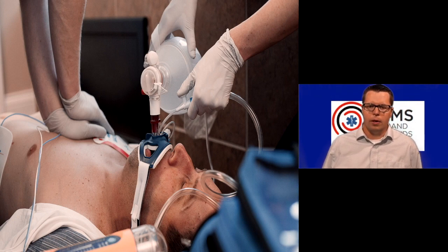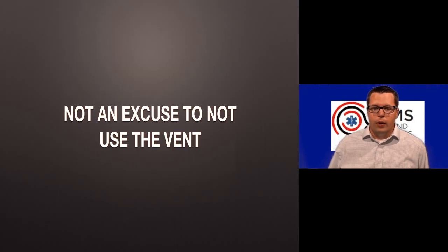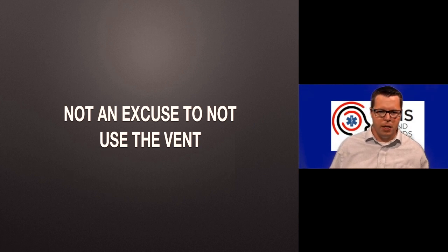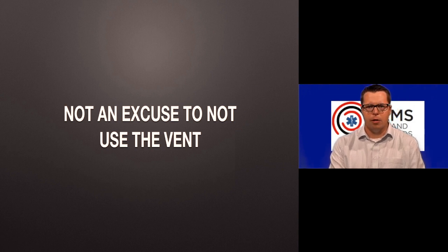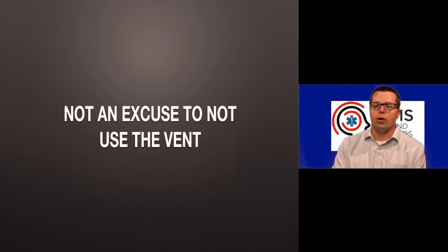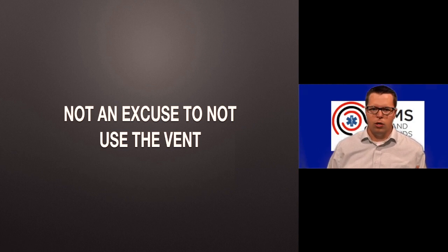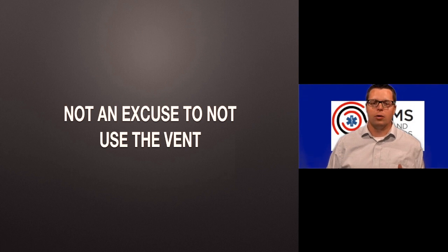and that'll be important in a couple of minutes here. What I do want to say real quick is that this is not an excuse to not use the vent. Just because you can use the bag effectively in the way that you should, that's not a good excuse to not use the ventilator, because the ventilator is still going to be safer and superior if you know how to use it in most cases. We should not be skipping the vent just because you have a bag and you can do all this kind of stuff that I'm going to talk about. That's just really great use of the bag. The vent is still the better choice if you at all have that option. So you should use the vent whenever possible.